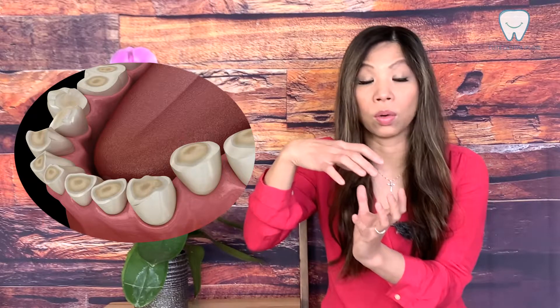So what's the difference between a night guard and a TMD device? The major function of the night guard is to protect — to protect from grinding on your own teeth. When you wear a night guard at night and you are grinding your teeth, you are grinding on the plastic instead of your own teeth. For some severe grinding patients, they can actually grind a third or even half of their teeth away and actually expose the nerve. I hope you're now thinking that wearing something on your teeth at night is important.